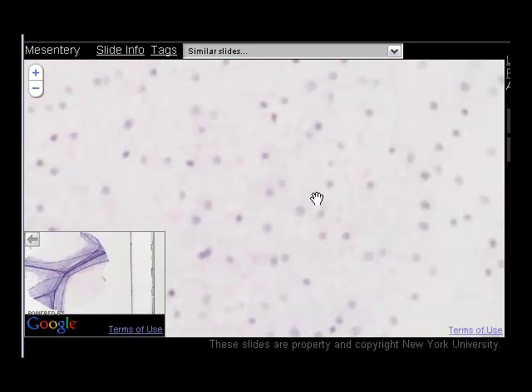If you had to guess at the identity of the cell types here, your best guess would be, if you were asked on any of these nuclei, a fibroblast, because fibroblasts make up the majority of the cell type that can be found in loose connective tissue.